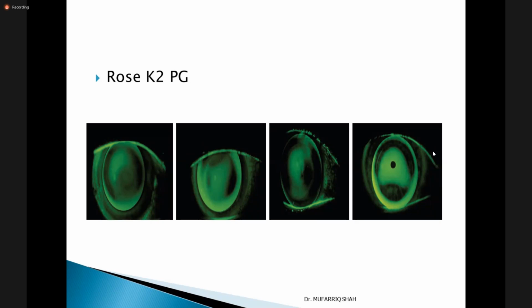The periphery fitting is good, but the central pooling is much greater, and we already discussed that in case of early graft, the central pooling will be 0.2 to 0.3 millimeters. So this is a case of early graft. So here, in our circumstances, you will need to wait for it, because after maybe 6 months or 8 months, the lens parameter will change.